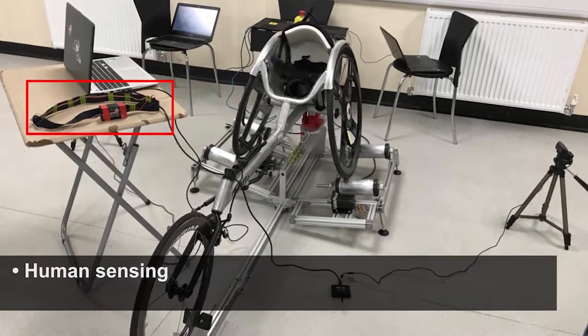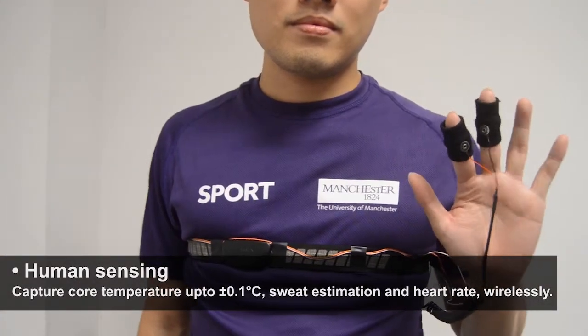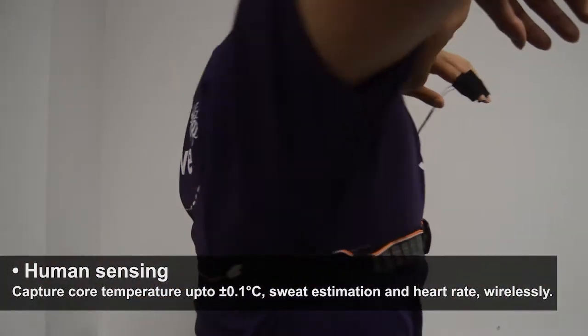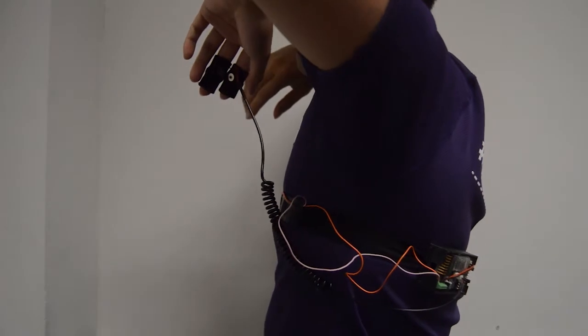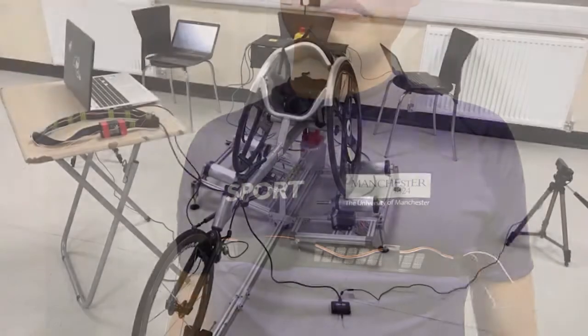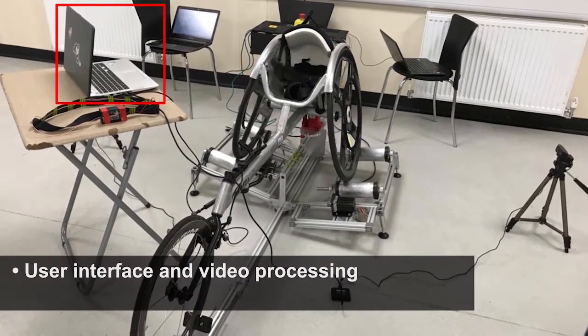The next main aspect of the system is human sensing, which delivers two new modalities of core temperature measurement up to an accuracy of 0.1 degrees Celsius, and sweat estimation of the athlete's body. Together with last year's heart rate monitor, all three modalities are combined into a single chest strap, called the sense belt.